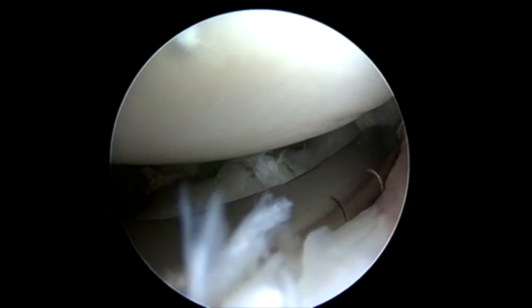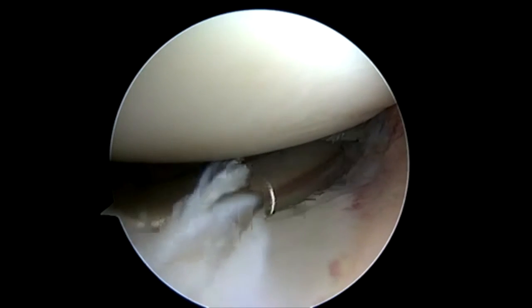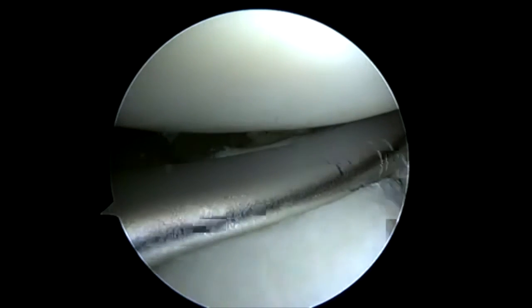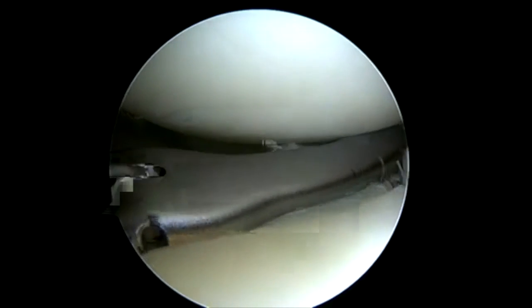Now we've switched to our lateral portal as our working portal, visualizing medially. You can see we're able to get a good pass around the meniscus and into the capsule. Sometimes it takes just a little bit of fidgeting to make sure that you get the lower jaw where you want it for the secondary pass.